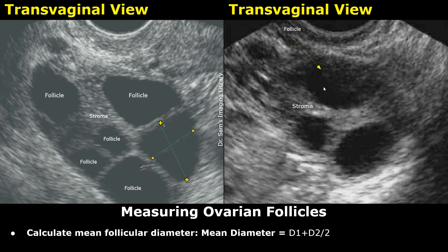Always measure the follicle at its largest visualized size. Measure inner wall to inner wall. Obtain two perpendicular diameters. Use the mean diameter for interpretation. Consistency in technique is essential for accurate serial monitoring.